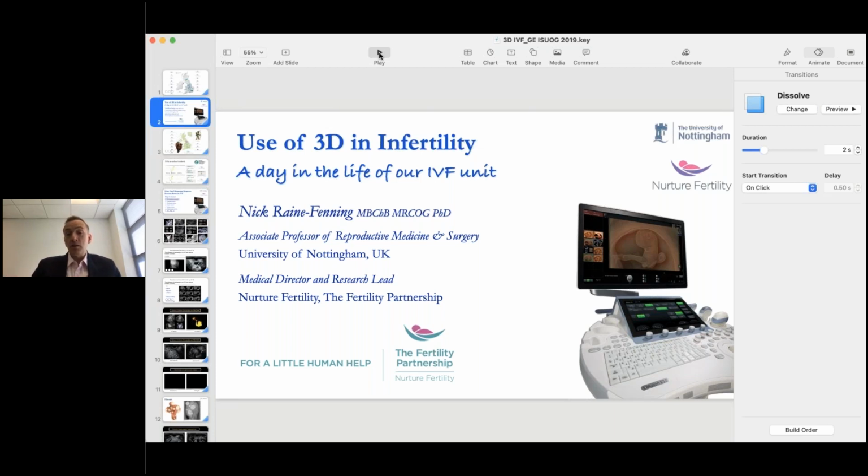Yes, there's lots of follicles and patients over respond, and I know that's a very particular issue that you struggle with and that you have a much higher prevalence of. But what we also know is a lot of these women have poor quality eggs. None of this you can tell really just from blood tests and from looking at the clinical phenotype. This is where ultrasound really comes into its own.